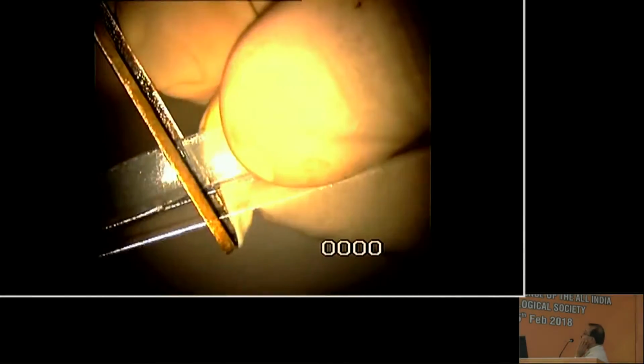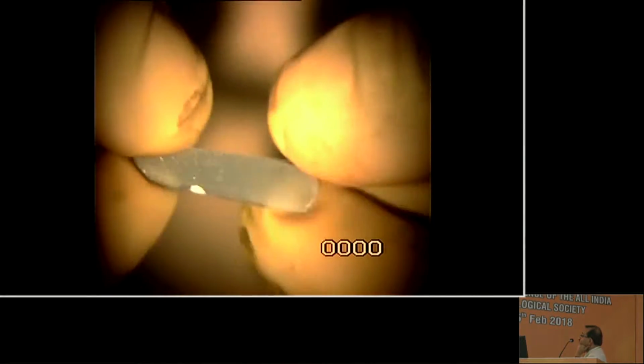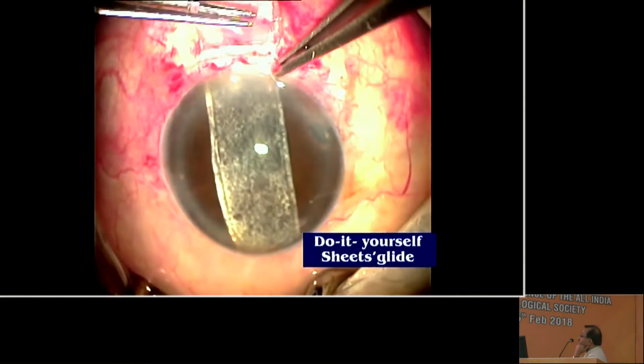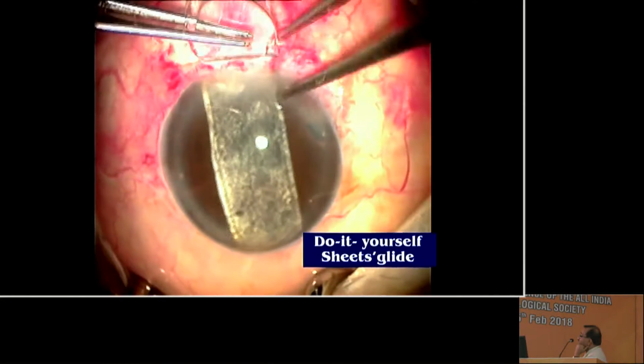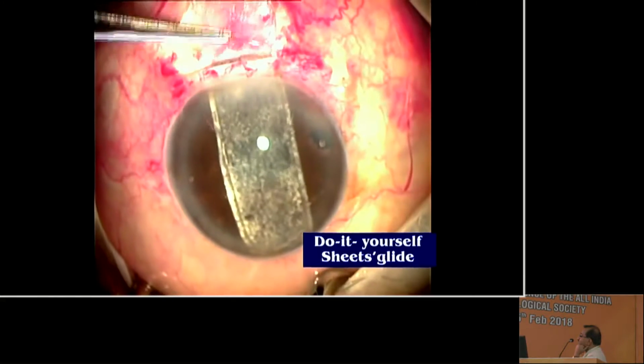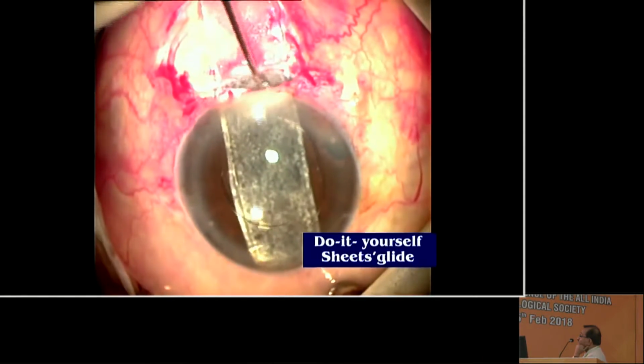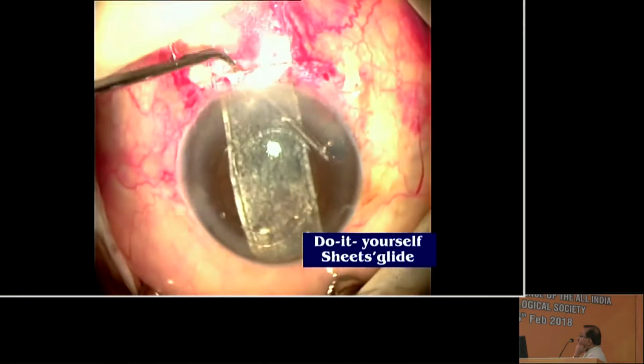The polyethylene blisters of IOL packs or suture packs may be cut to suitable sizes, ethylene oxide sterilized, and kept handy to facilitate AC IOL insertion. This helps smooth insertion without iris billowing, or malpositioning of the ACIOL in the AC, and may be withdrawn after insertion and proper positioning of the ACIOL.